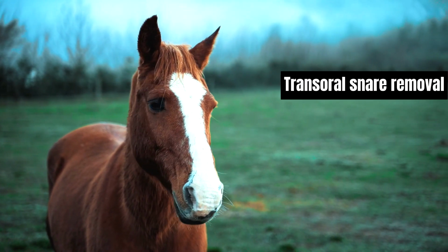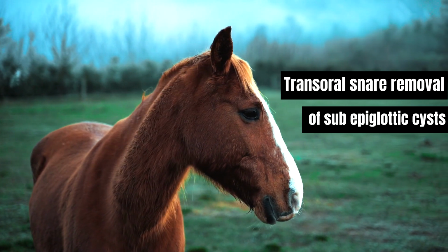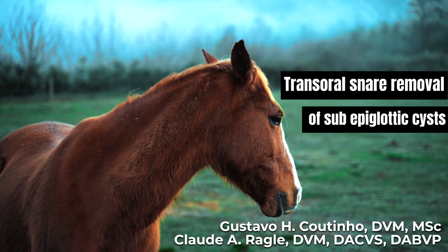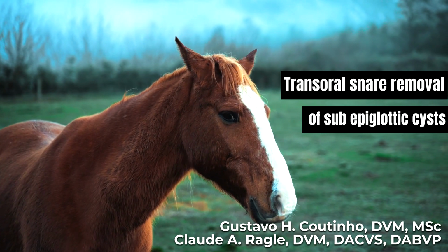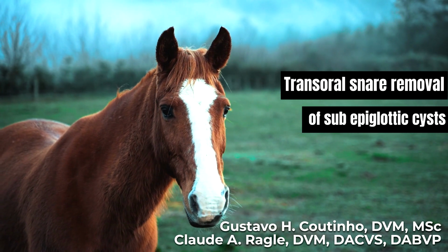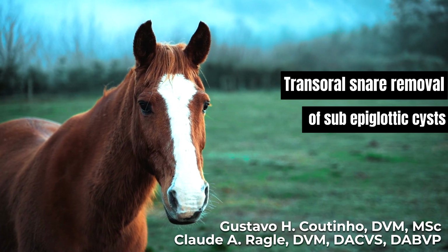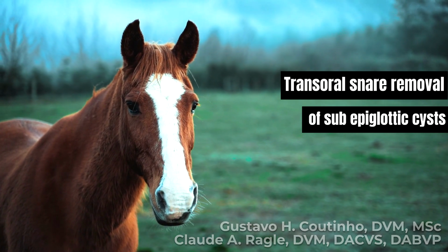The goal of this video is to describe a surgical technique of removing subepiglottic cysts in horses via the oral approach under endoscopic guidance in the dorsal recumbency. We have no conflicts of interest to disclose, and I want to thank the WSU Anatomy Lab for the help.